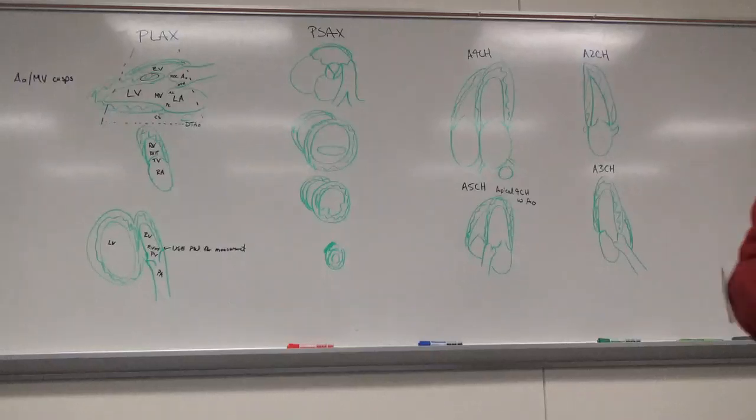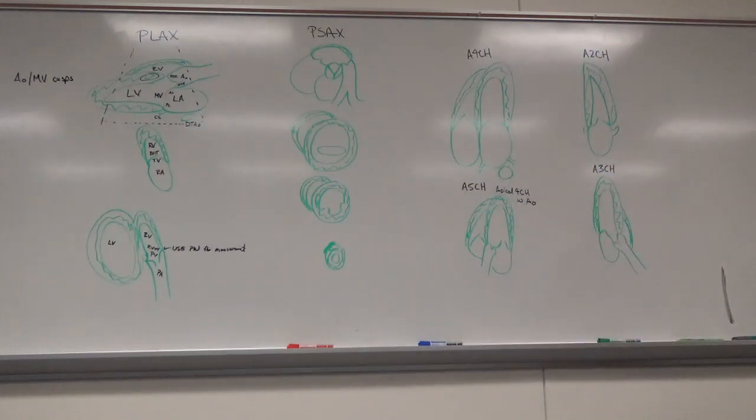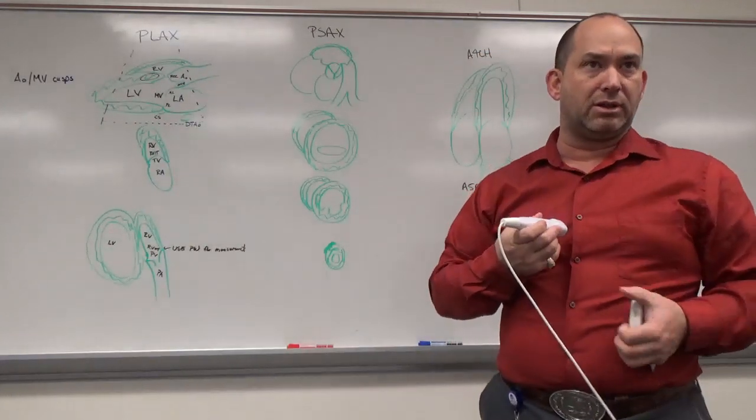Okay? And you were saying like kind of rock your way down? Yeah, so in class I was kind of showing, see if there's something I can use. Well, how about a transducer? That would be great. So when I'm scanning, I'll use the transducer like this. I'll be scanning along, and Tammy and I, we all do it a little bit differently, and that's okay.